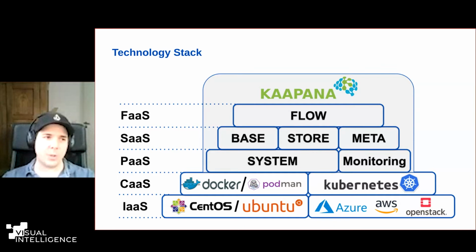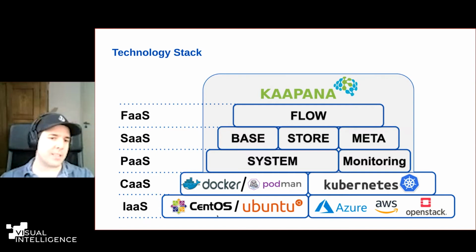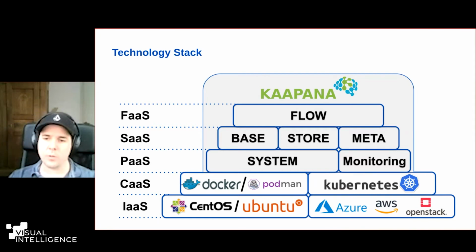So we basically use the technology, but we don't use Amazon or Google, we have our own servers and we deploy everything on premise within the clinic. So there's basically no external connection needed whatsoever, but we still have this nice technology. On top of that, what we need to run is basically just any kind of Unix operating system. Usually we use CentOS or Ubuntu.